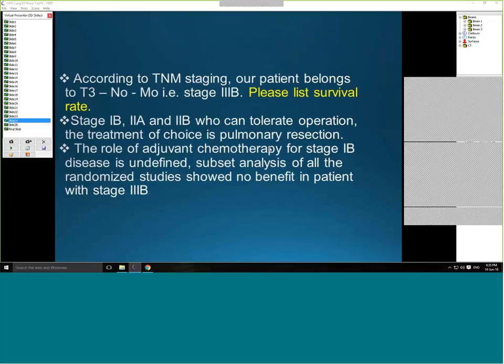At the end, what we try to do is bring this back to radiation therapy, because that's what we're assessing the students on, and that's what we're training them for. So here, the students have 2 activities. One, they have to set up the treatment field on the conventional simulator using a 2D film, and 2, setting up the same field on the Vert using 3D technology.